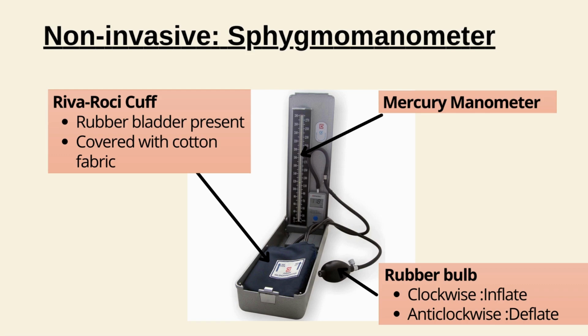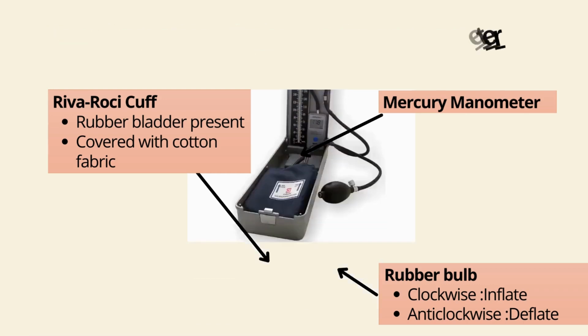The gauge is a meter that displays the pressure readings. It may be a dial gauge or a digital display, depending on the type of sphygmomanometer. The release valve is used to control the rate at which the pressure in the cuff is released. This is important for getting accurate readings. The stethoscope is used to listen to the patient's pulse as the pressure in the cuff is released.